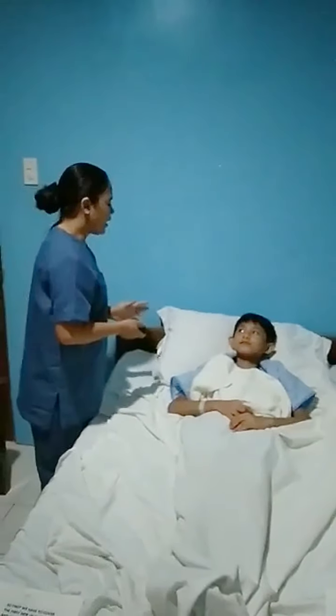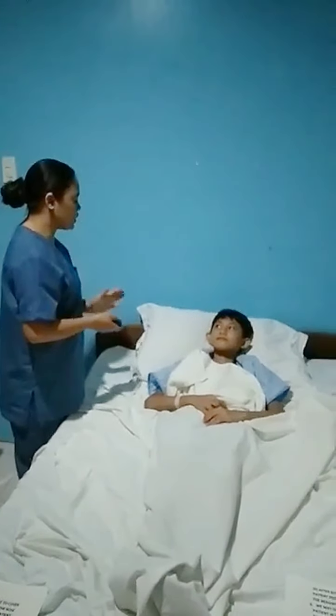Next is to assess the patency of the nare. We can use a pen light to check if there's any obstruction inside the patient's nose. So Ryan, I'm going to check your nose if there's any obstruction.